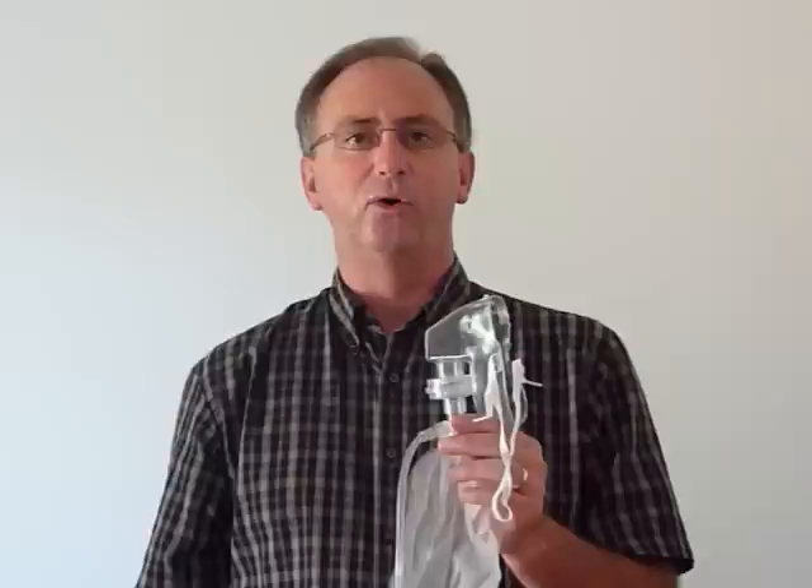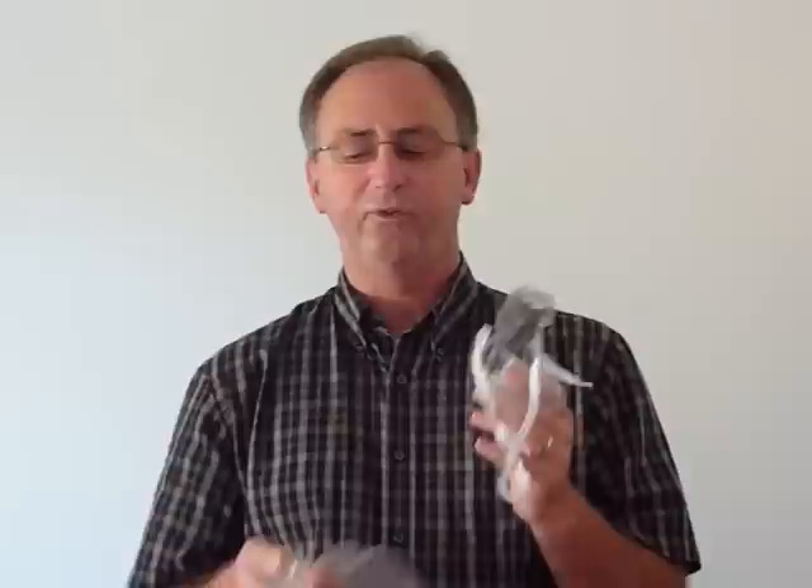This is our Flow2Max Isolation Oxygen Mask Delivery System. It's five masks in one. First, it's an equivalent to an N95 mask. It's also a low, medium, and high concentration oxygen delivery system, as well as a nebulized delivery system.